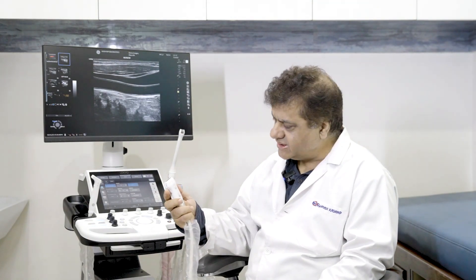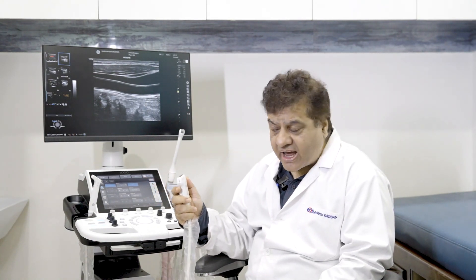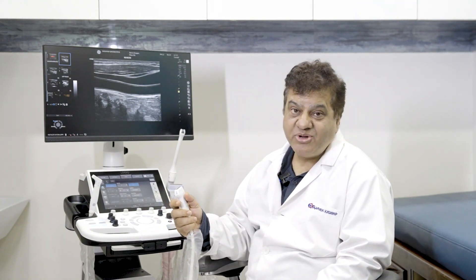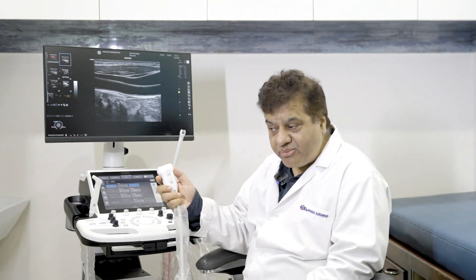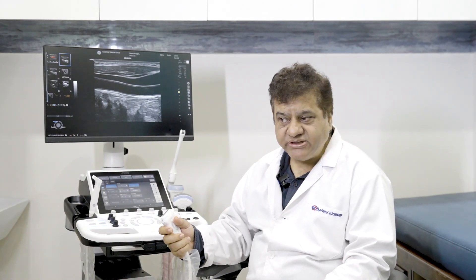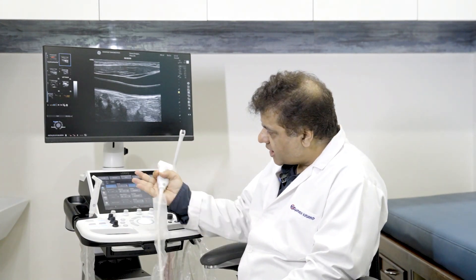I want to highlight this transducer — the L4-12 Touch. What is fabulous about this touch probe is that it has four buttons which allow you to control gain, control depth, switch color on or off, freeze, defreeze, and even use the print button — all from the probe itself. The advantage is that if both hands are occupied, for example during a procedure or MSK work, a single hand can operate the probe with no need for foot switches.